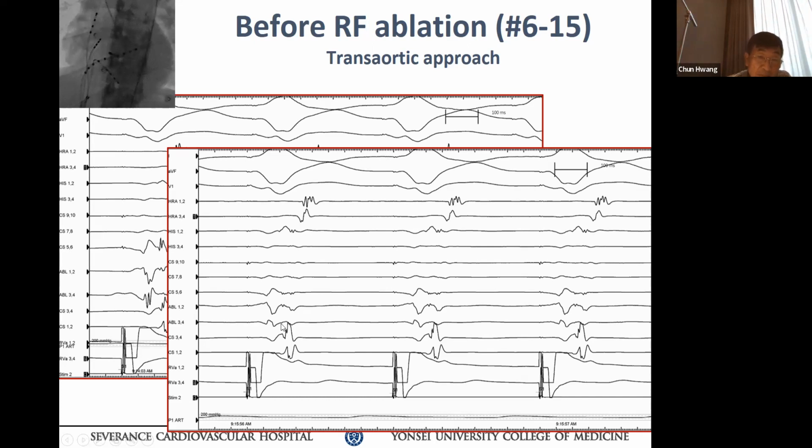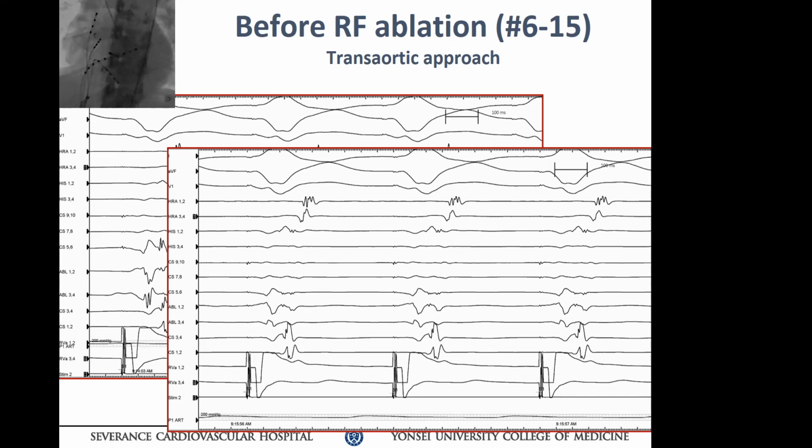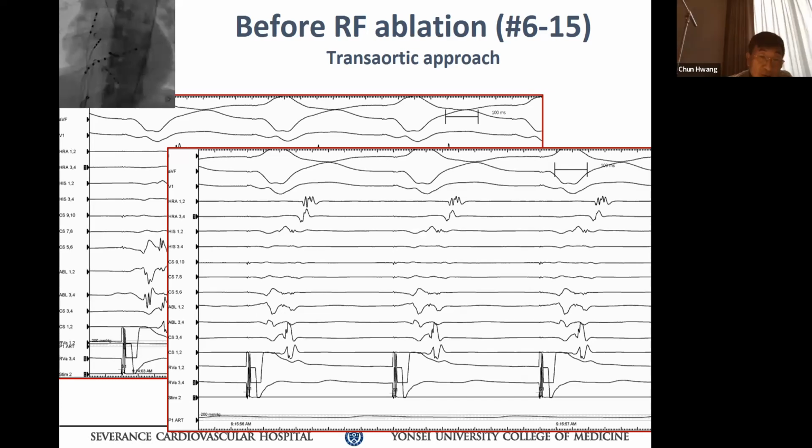They're same. 그지? 비슷하지 타이밍이. 그런데 뭐가 거기 interesting해? Your polarity reverse there. Positive and negative. Very beginning is a negative 3, 4. Positive in ablation 1, 2. 그게 무슨 소리야? Your pathway is between two, breaking through.